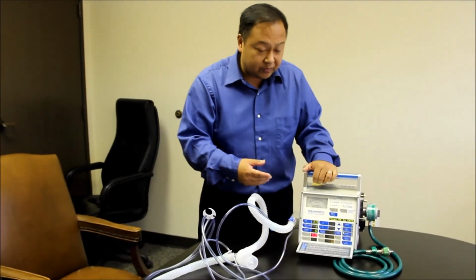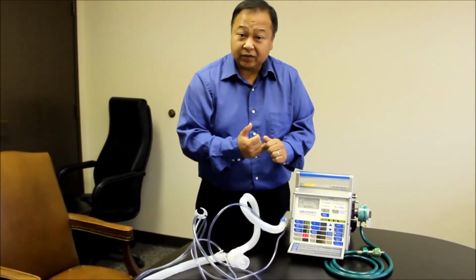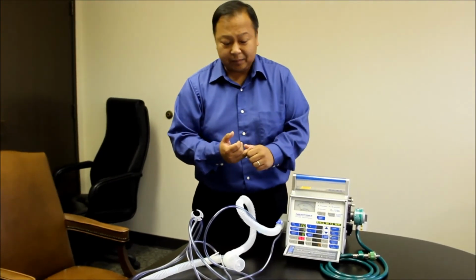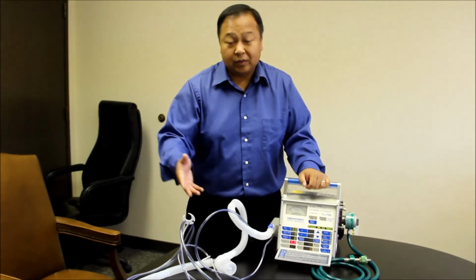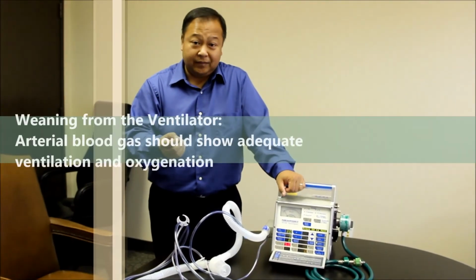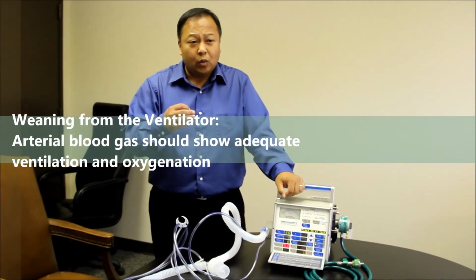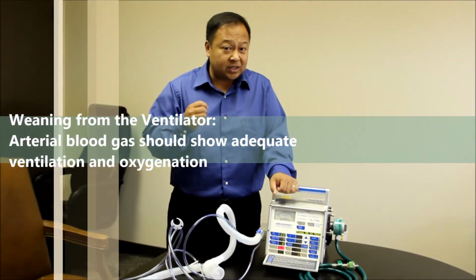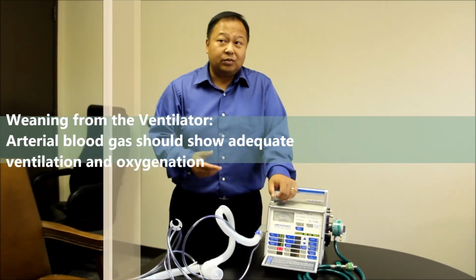We discussed pretty much why patients are put on the ventilator, the different modes of volume controlled ventilation, the AC, SIMV, CPAP, and how to troubleshoot alarms when they actually go off. The last thing I want to talk about is weaning. Weaning is important because patients can't be on the ventilator forever, so we have to figure out what parameters we use as nurses to see that this patient is ready to be weaned or even extubated off the ventilator. So there are 3 things we look at.